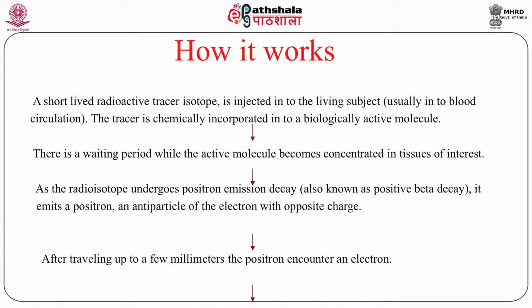Now, when the glucose is taken up by the cells, the cells won't understand whether it is sucrose, fructose, glucose or fluorodeoxyglucose. The cell takes it up and gets energized, and what happens? Glycolysis takes place and whatever remains trapped in the cell is fluorine-18.